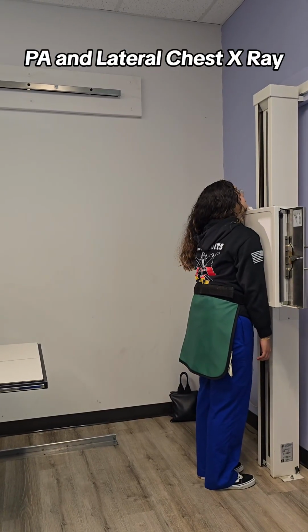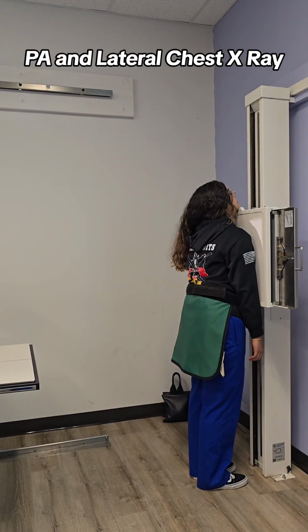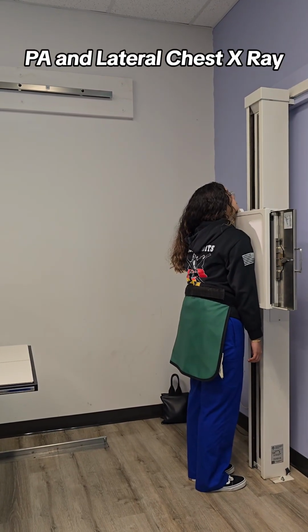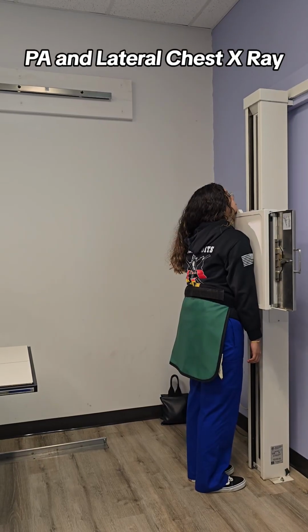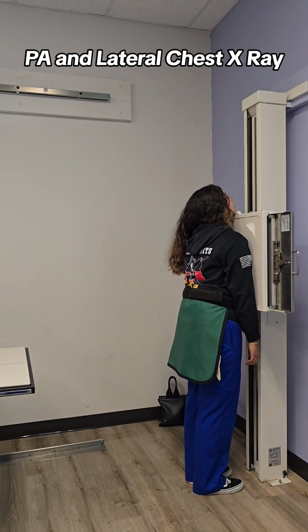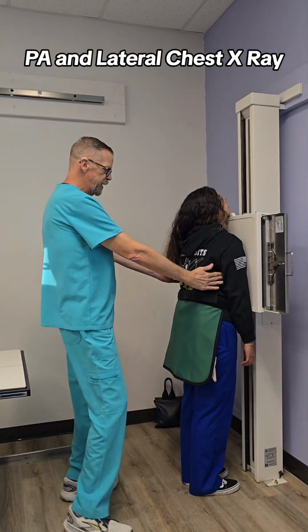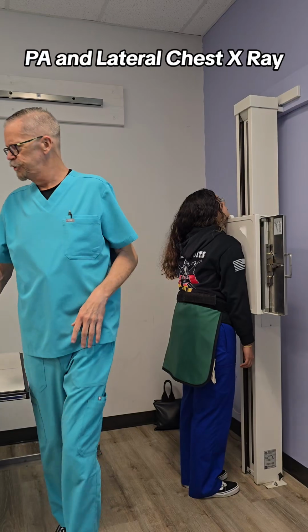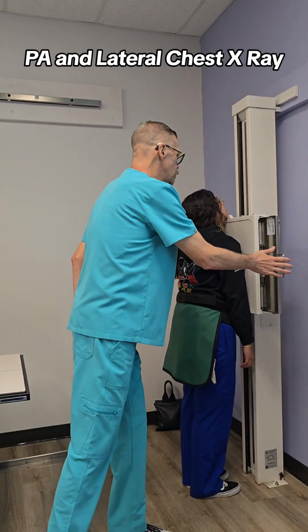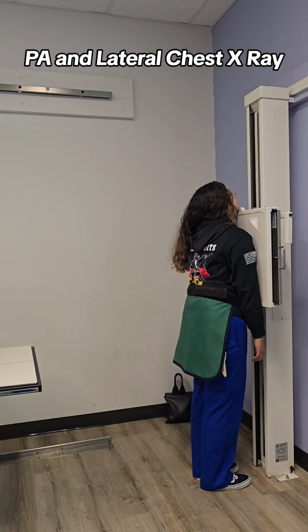Side to side, no more than 14 inches, because again, our image receptor is 14 by 17. So 14 is the most. Right now I can see some light on the other side of her arm, so I can close it up a little bit. Now I'm collimated right to about here and here, so more than enough collimation. Close my image receptor up. Make sure that I'm lined up, that I didn't move anything.